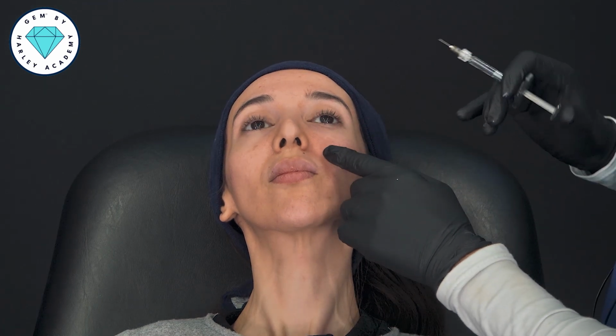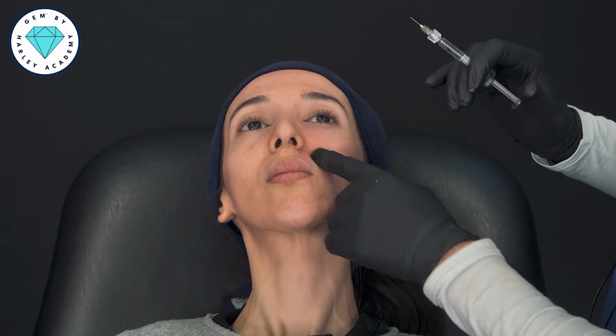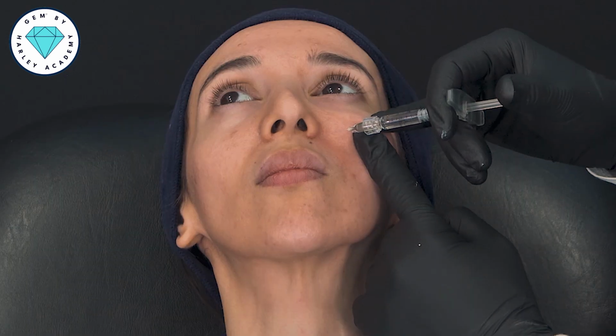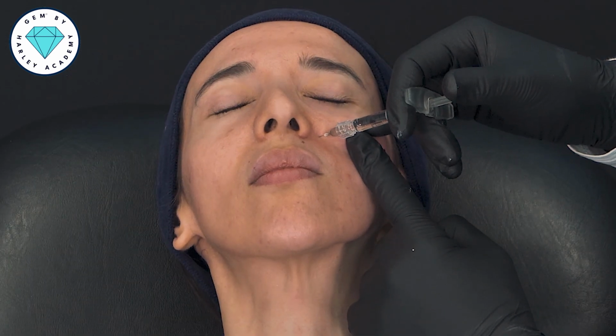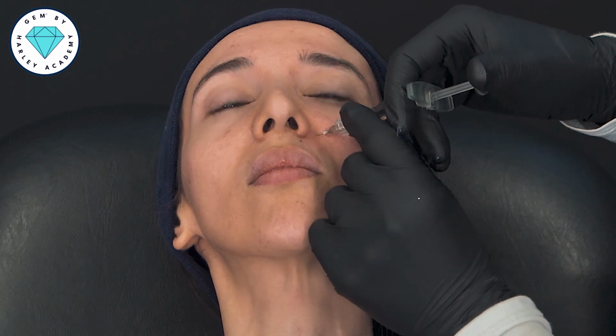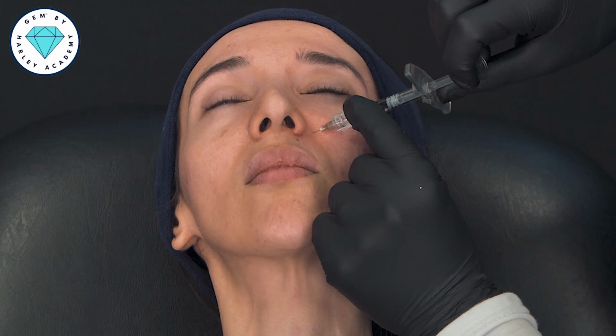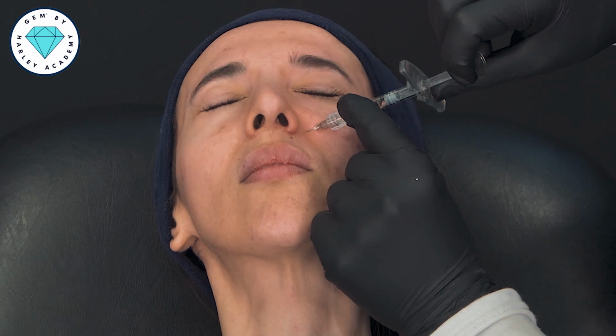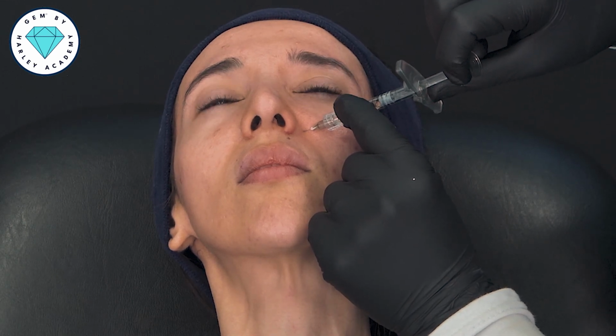Final treatment on this side of the midface is going to be an injection down at the piriform fossa. This one is going to give support to the entirety of the midface. With this one, it's important that we very definitely touch down onto bone and aspirate. We're injecting in a potential space that exists medial to the deep medial cheek fat. A little scratch. Well done. So down onto bone. This is an injection down onto the maxilla, and I'm going to aspirate again, like with the temple, a good 10 seconds, because this is one where we have a very unpredictable course of the arterial supply.